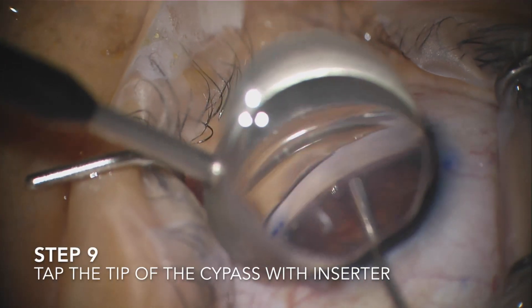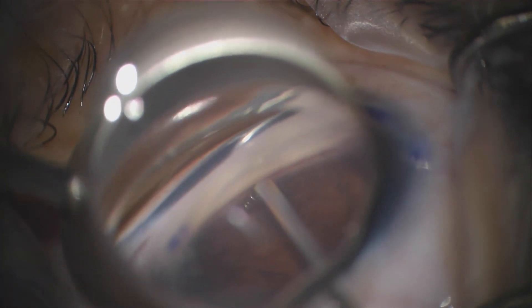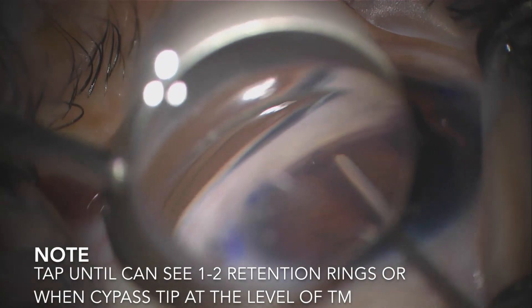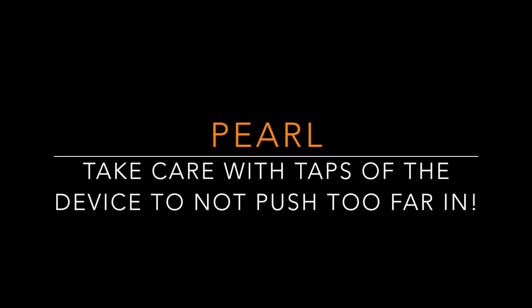Then just slowly tap the tip of the device into position. As it glides into position, you know that you're in the correct space. At the end, there are retention rings that help you get a sense of how far in you should tap. The tip should be right about the edge of the trabecular meshwork. Be very gentle with your taps, because it is possible for the CyPass device to be pushed too far.